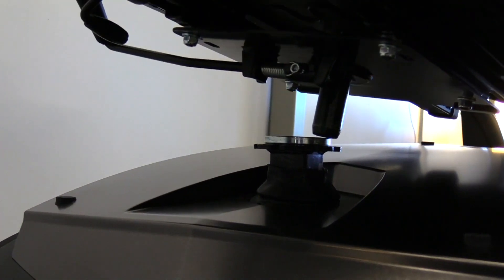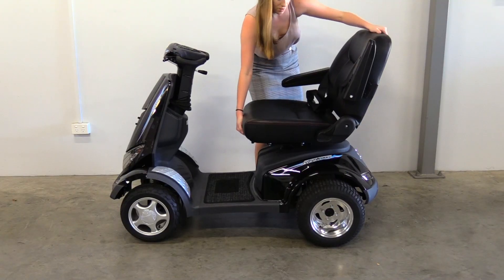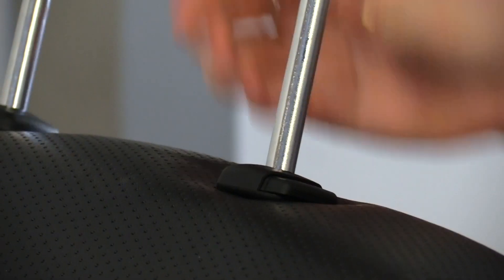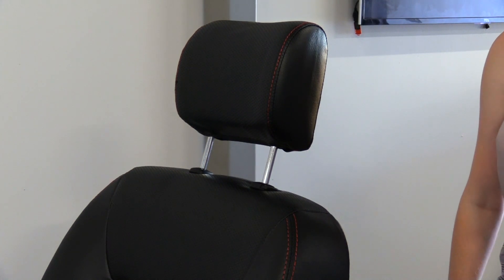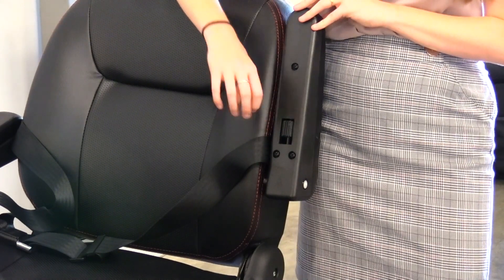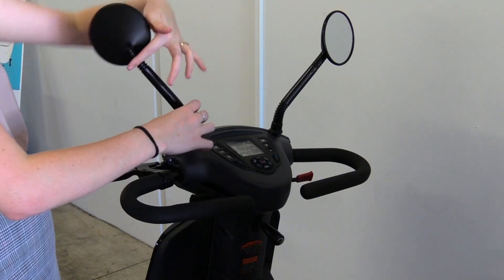To attach your seat, line the bottom up with the mount and slide it in. To attach your headrest, slide the bars into the headrest points. The height can be adjusted by pushing the button and positioning the headrest. Your armrest will also need to be adjusted — lift the armrest up and roll the adjustment dial left to increase the angle. Your mirrors will need to be screwed in near the control panel.